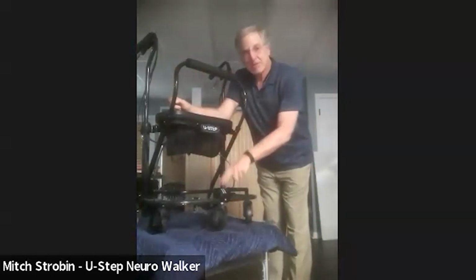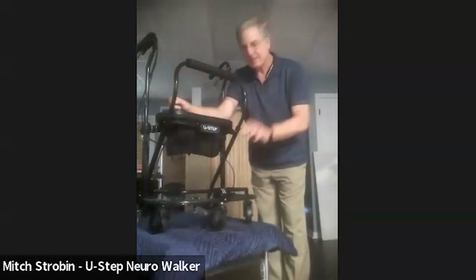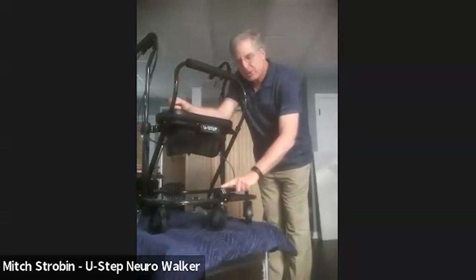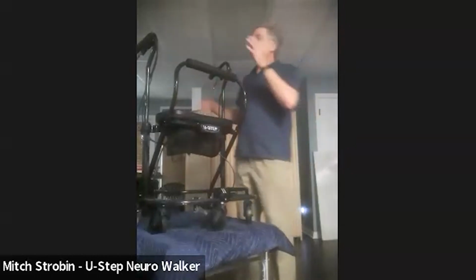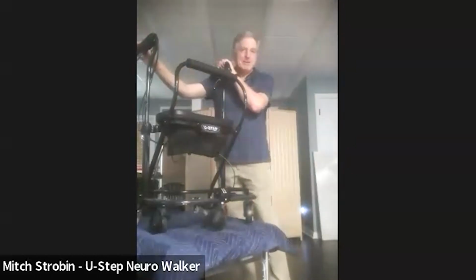Okay, so the front middle wheel of the U-Step also has a special purpose. So hopefully you can see this has a Roman numeral 2 on the front cover. It's the front middle wheel. Behind that cover is a spring. Think of it like a shock absorber. Why do we have a shock absorber in a car? To lessen the impact of going over a pothole. Now I know there's no potholes in Colorado, right? None? Yeah, maybe a few. But we hope no one goes over a pothole with their U-Step.